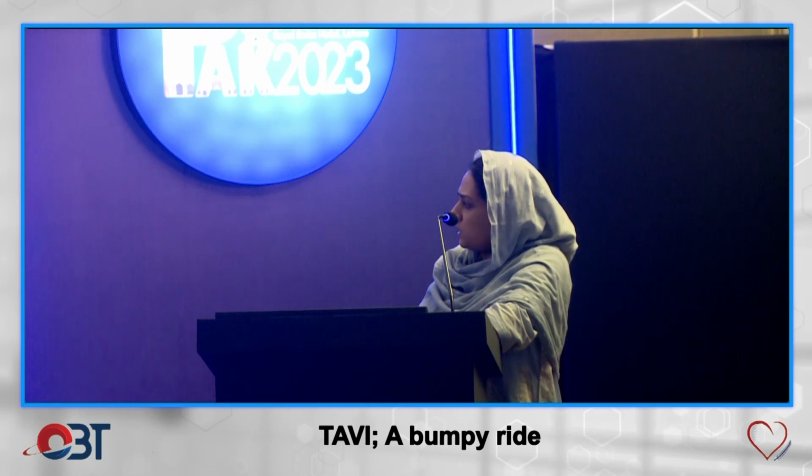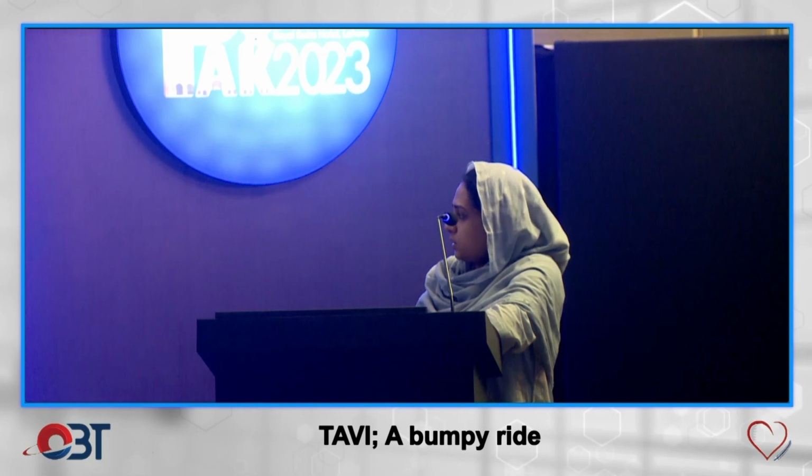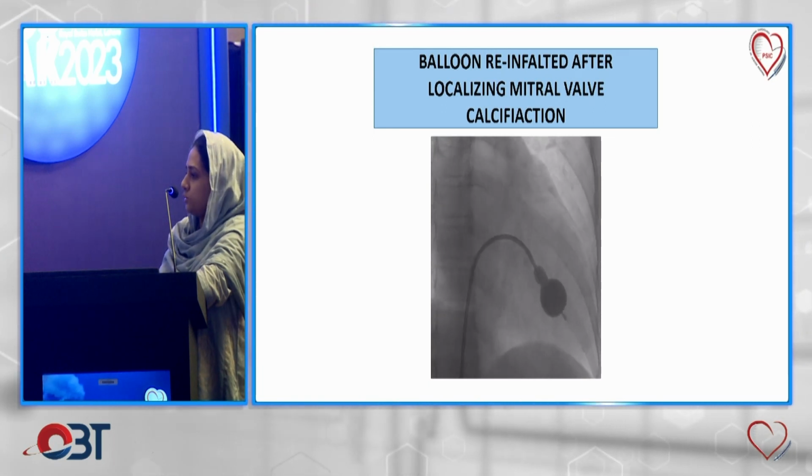I hope the calcification of the mitral valve is visible to all. So the balloon was then pulled back using calcification as the landmark, and it was re-inflated. After a couple of inflations, this time a fall in gradient was observed.